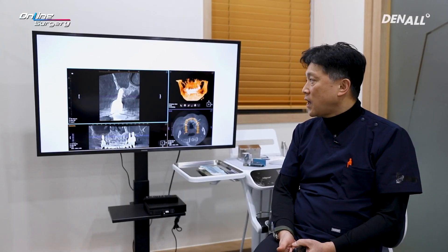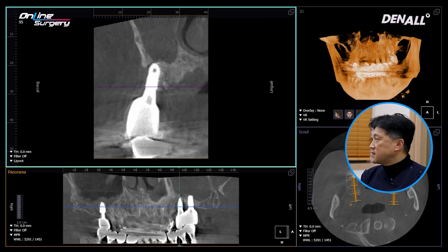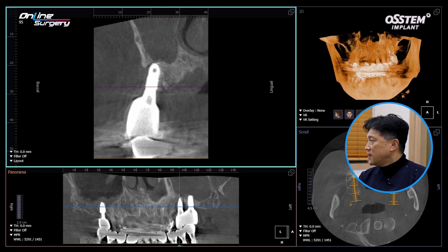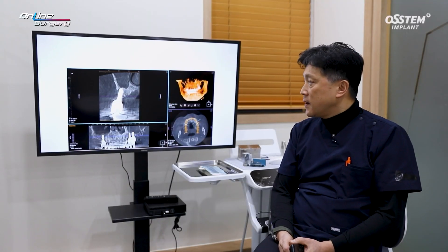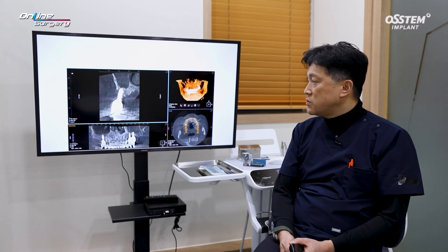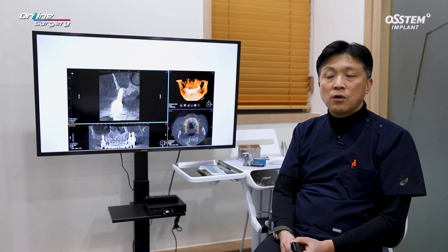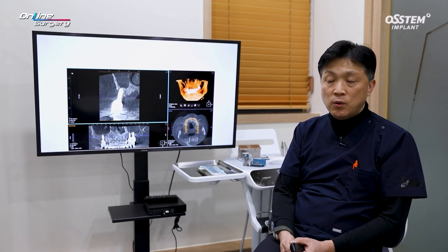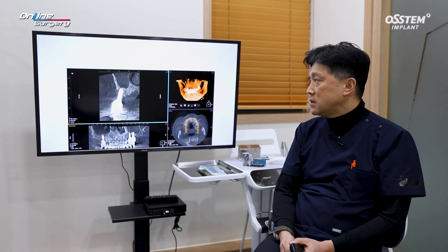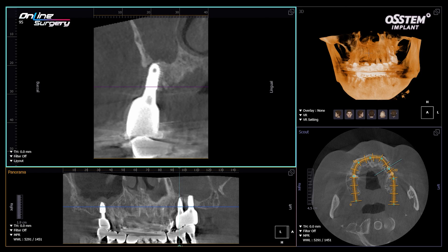I'm going to show you how surgery was performed this time around. If you look at the pre-op CT, because of periimplantitis, you can see that there is total ridgelessness on the left side — there is significant buccal bone loss. If you just remove the implant and wait for regeneration, there will be issues with buccal bone regeneration, and upon re-implantation it may require additional GBR. I'm going to show you how bone graft was done prior to implant placement.